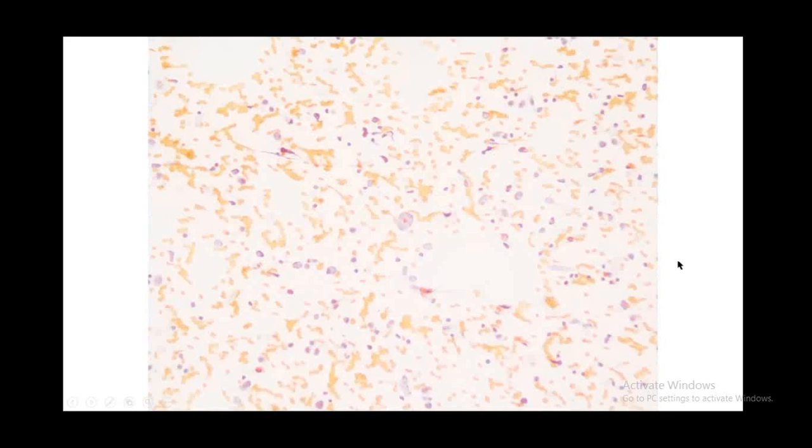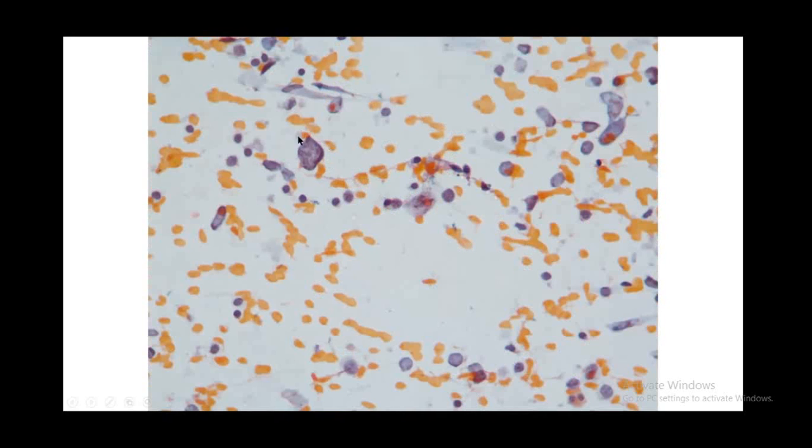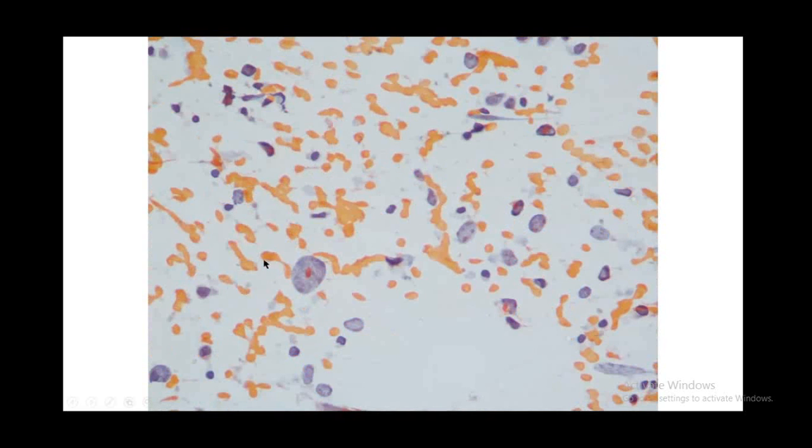The Pap smears again showed very pleomorphic nuclei, and they showed a lot of cell size variation, and the background showed some lymphocytes. And these very large singly scattered atypical cells with prominent nucleoli were quite unsettling. There was a crushing artifact. Again, some malignant cells were seen entangled with these, and the tumor cells really showed marked cytologic and nuclear atypia, although the cytoplasm was not very well preserved. Nuclei were mostly seen as naked nuclei without any preserved cytoplasm.